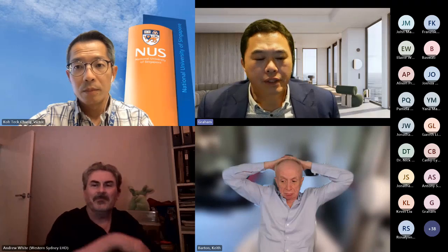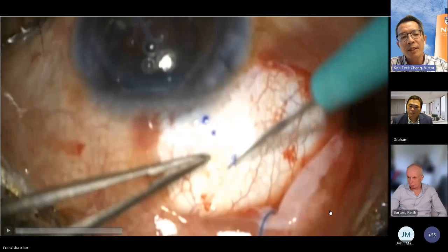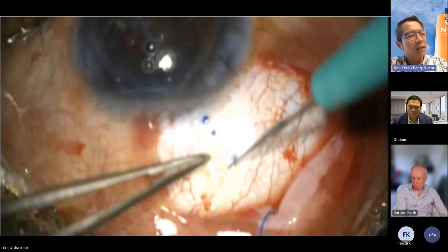Victor, did you want to present your intrascleral tube insertion? Yep. I think in Singapore where I practice, we don't have sclera or cornea that is easily available, and so the most common patch that we have is the pericardial patch, which I think you and I know tends to melt, tends not to last for too long. We have the fascia lata. The fascia lata is a lot more expensive. I always thought it's a bit more bulky and thicker as well. So sometimes I do get Dellen formation as well.